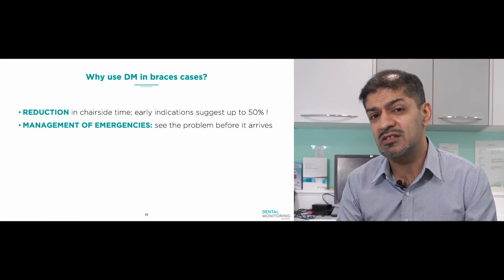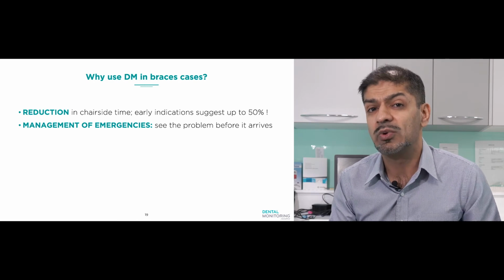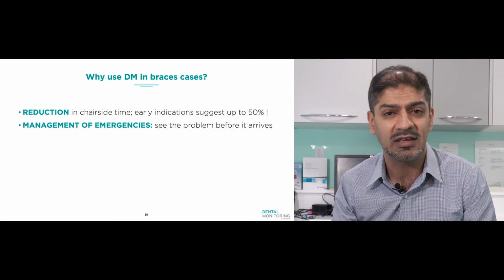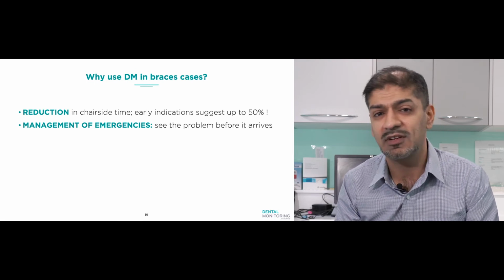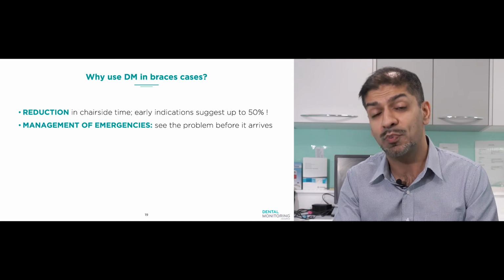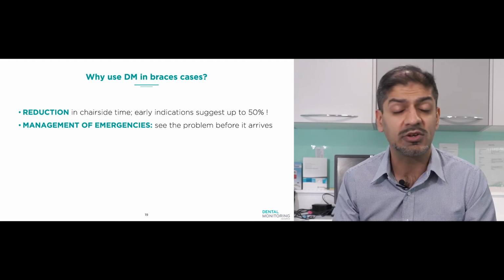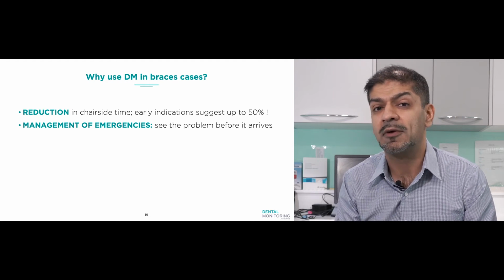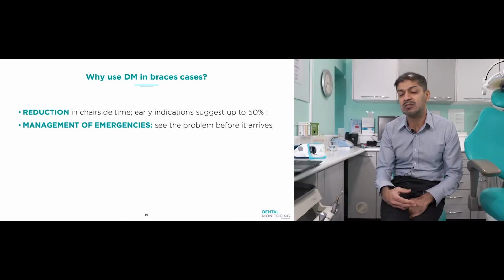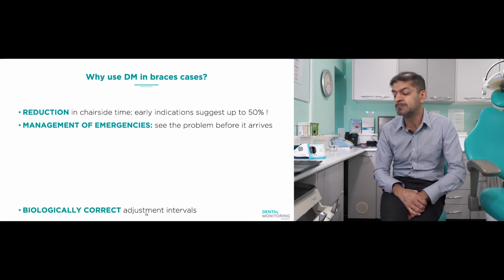Dental monitoring for braces cases is fantastic when it comes to management of emergencies, because we can actually see, for example, a broken bracket or a wire that's digging in before the patient even actually knows about it themselves. And so we're often able to contact the patient to say, we know your bracket has come off, and either we need to see you for an intervention, or we know it's come off and we don't need to do anything at this stage. And also allows for that to be delegated, because a staff member can look at those things and book that appointment in without me having to actually get involved in any way.